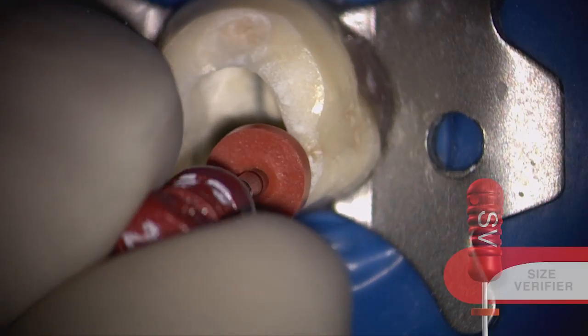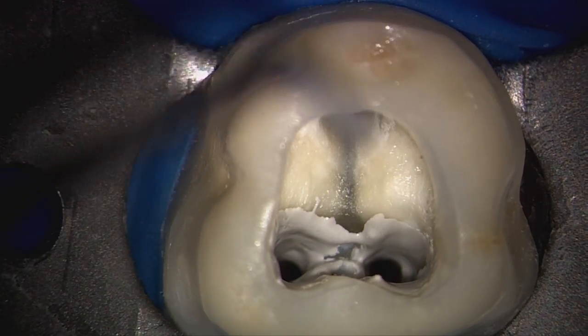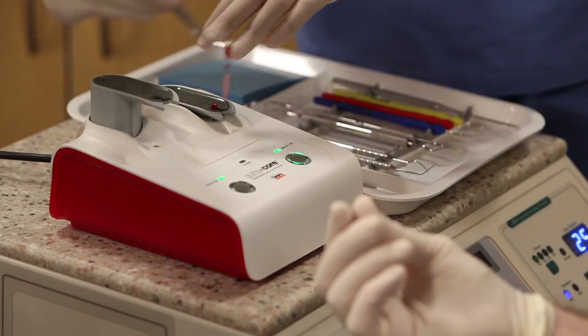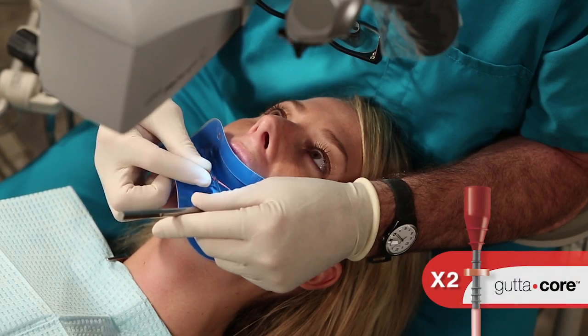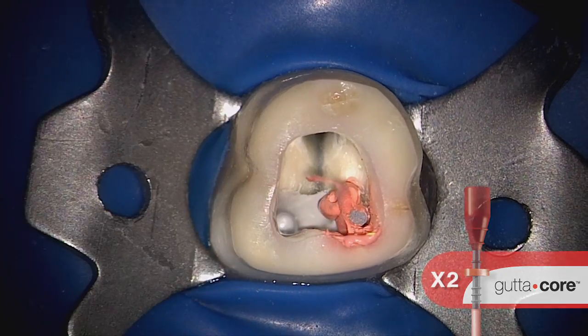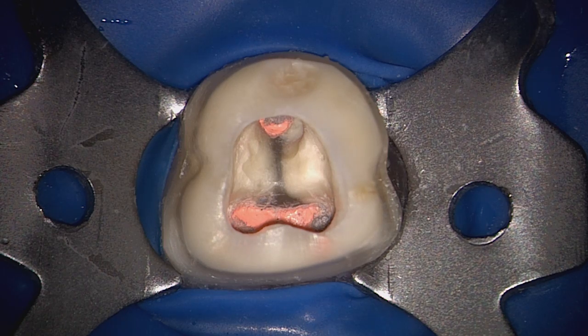Here I am using a size verifier that matches the last Protaper Next file that was carried to length. Mix the sealer of your choice and insert it into the canal orifices. Now we can use a Gutta-core obturator. Coming out of the oven, there is sufficient thermoplasticity to easily carry a wave of material to length. Once this obturator has been carried to length, rock the handle gently, back and forth, to separate the coronal aspect from the radicular part. Flush out the tooth in preparation for provisionalization.